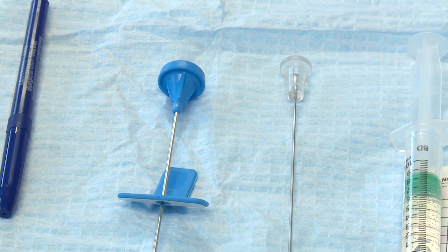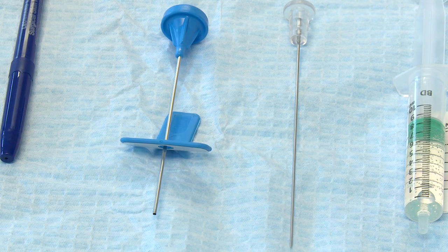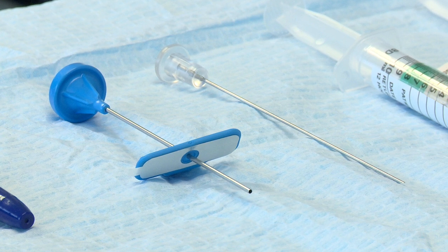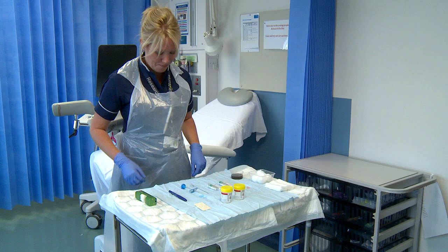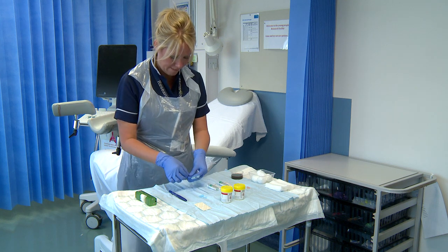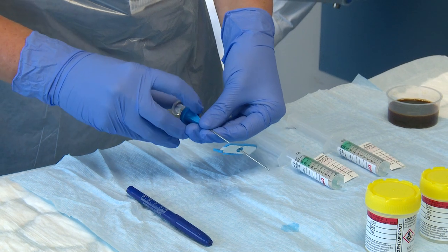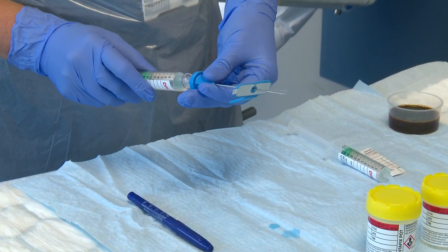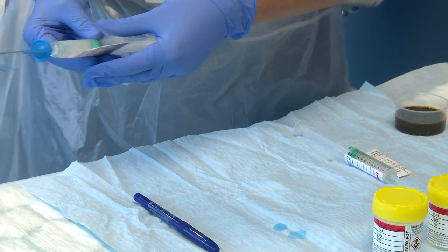The CAMPRO device consists of an integrated needle for simultaneous local anaesthetic delivery as the device is advanced, and a sheath within which the coaxial cannula can be used to perform the biopsies. The local anaesthetic syringe is shown being attached to the CAMPRO device ready for insertion. To ensure lubrication within the cannulation system, approximately 2 to 3ml of saline is flushed through before the anaesthetic syringe is attached.